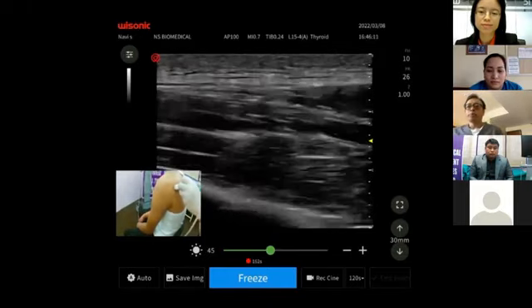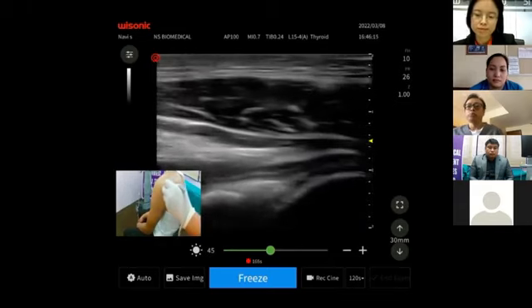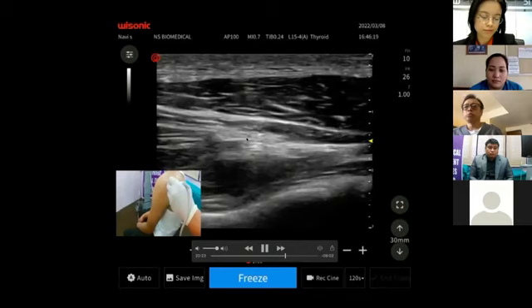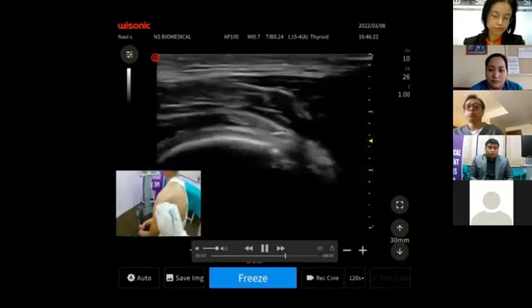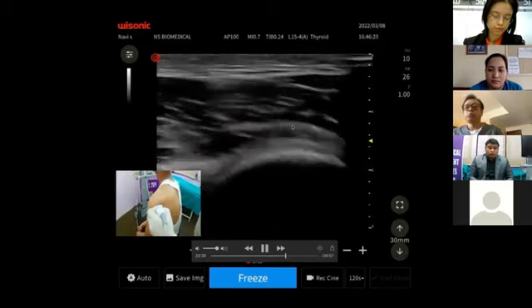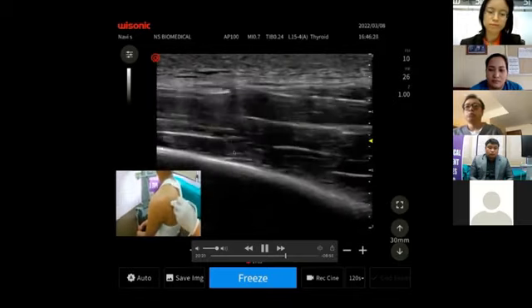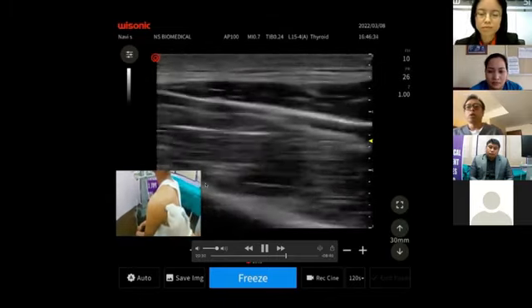As we can see again, the nice myofibrillar patterns, and we scan all the way laterally till we see it turning into the tendon. This is the myotendinous junction of the infraspinatus muscle. This is the tendon, and it goes and inserts to the greater tuberosity. So below the infraspinatus is the teres minor muscle, which starts on the lateral part of the scapula.